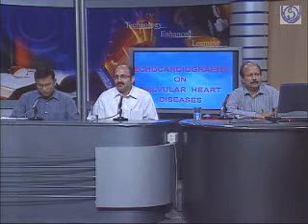Now what we had shown you was the cath derived data. In cath derived data, if you were to take peak to peak gradient, that is usually fallacious, because there is a lag phase between the left ventricular ejection and the aortic ejection. So the peak of the LV ejection would come earlier, and then there would be a peak of aortic ejection. If you were to take peak to peak gradient in such a case, it would actually be lower, because they're not occurring simultaneously. So that is why echo is definitely much more precise than cath.